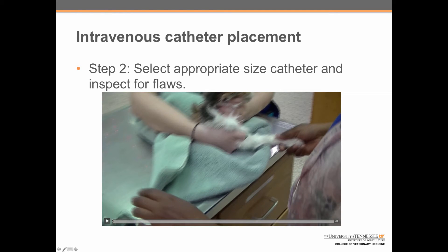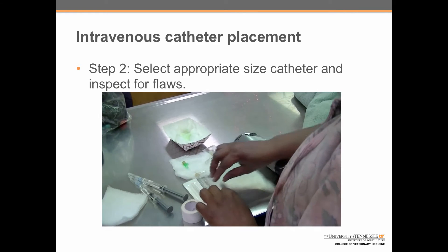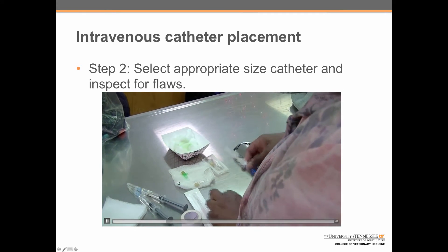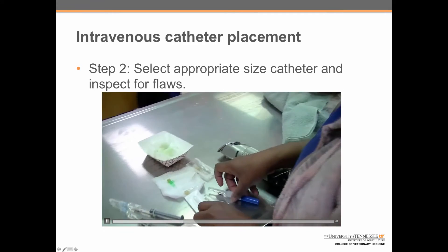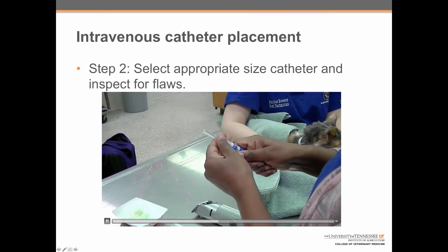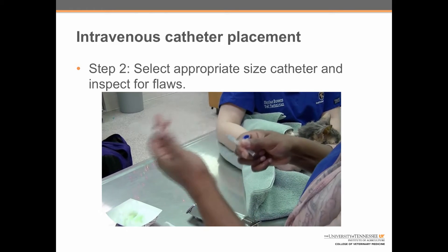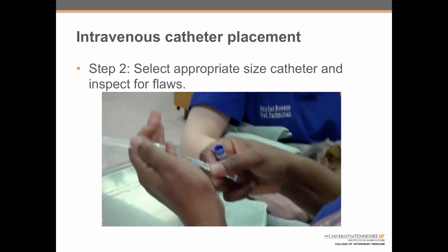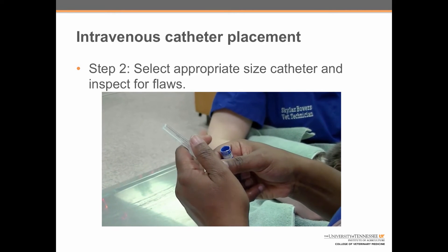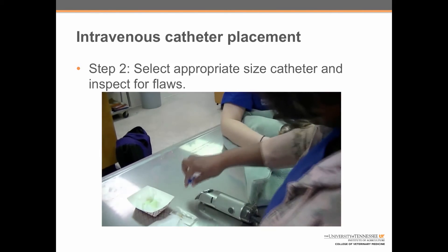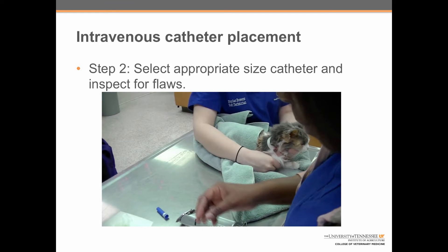Step 2: select an appropriate size catheter and inspect it for flaws. The most common catheter sizes used for cephalic catheters are 20-gauge or 22-gauge. For patients that you will typically see on service, a 22-gauge catheter is usually the right choice. We can see Shanna popping the back of the case off and then examining it to make sure there are no burrs or defects in the catheter, and then placing it back down within easy reach.